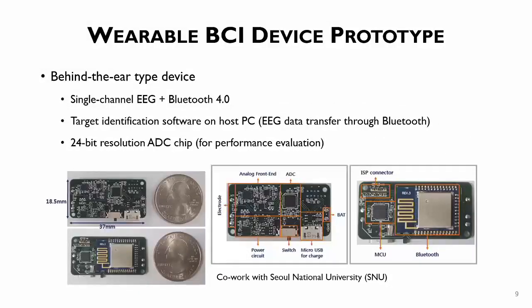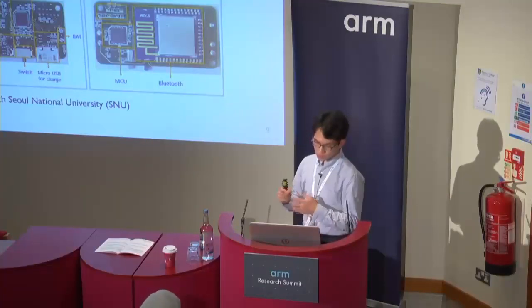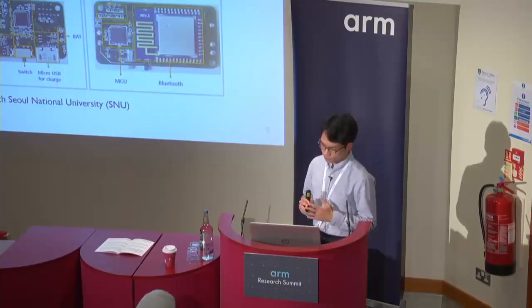Under the aforementioned research goal, we previously developed a wearable BCI device. We achieved a behind-the-ear type wearable BCI device, but still the signal processing had to be performed on an external desktop PC. We used single-channel SSVEP and raw data transmission through Bluetooth. And the host PC receives the SSVEP raw data and runs the target identification software.